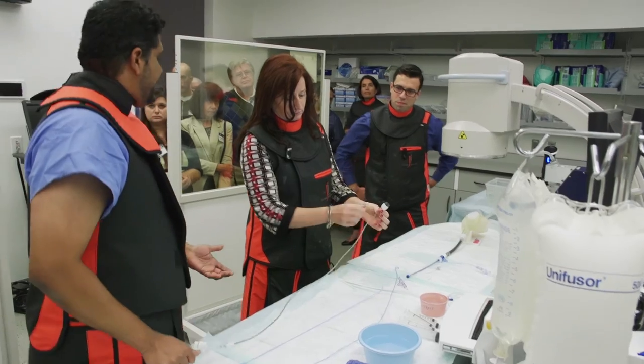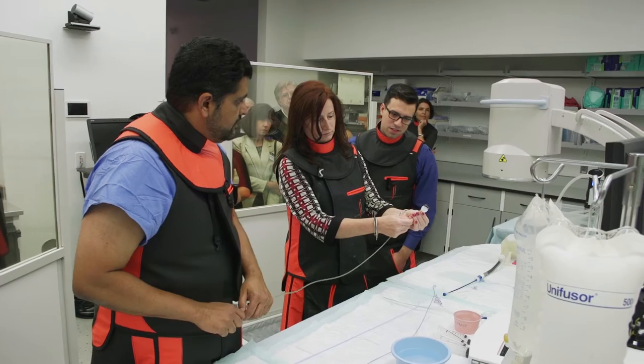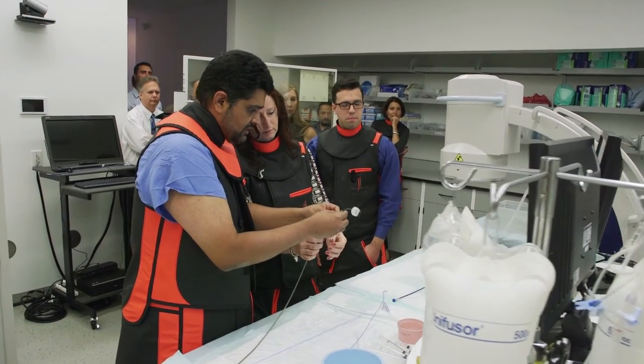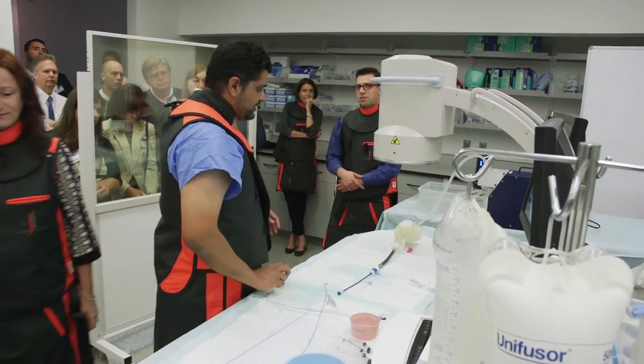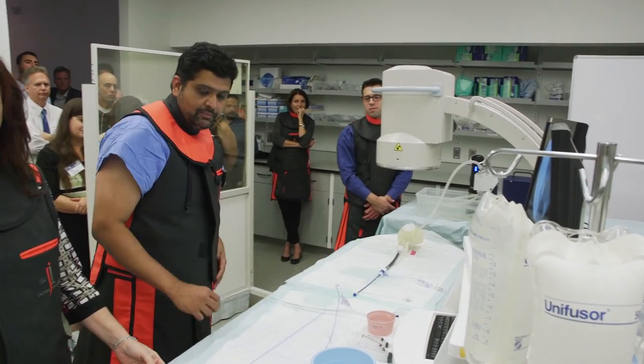This thing is made out of nitinol, so it kind of folds in. The sheath is kind of messed up — it's kind of accordioning out. We may not be able to deliver the device because these things are about $30,000, and the company is a little reluctant to give us too many of these. Here's our septum.